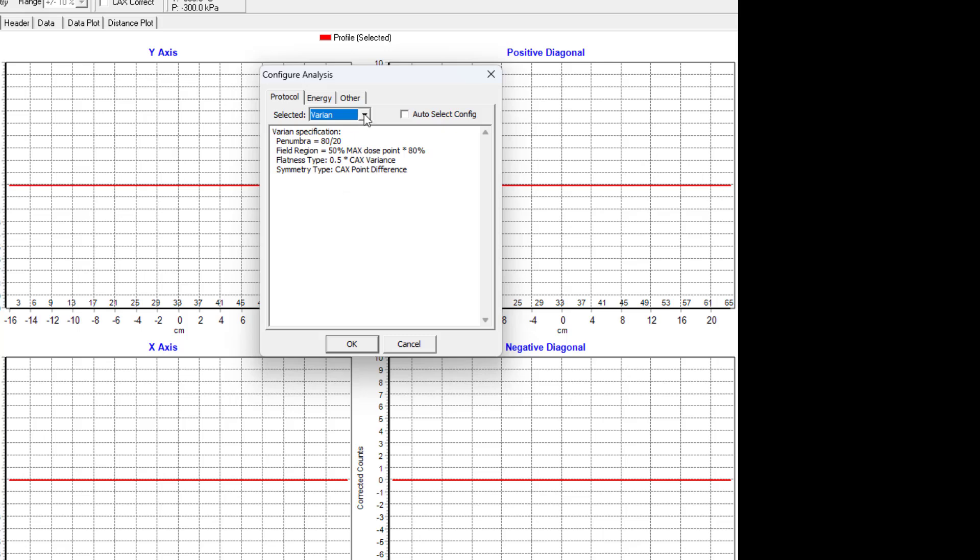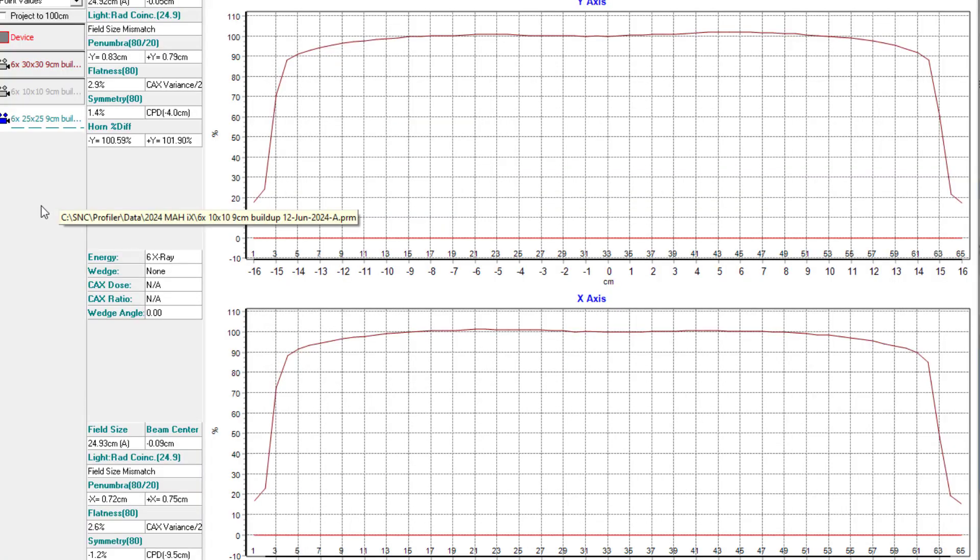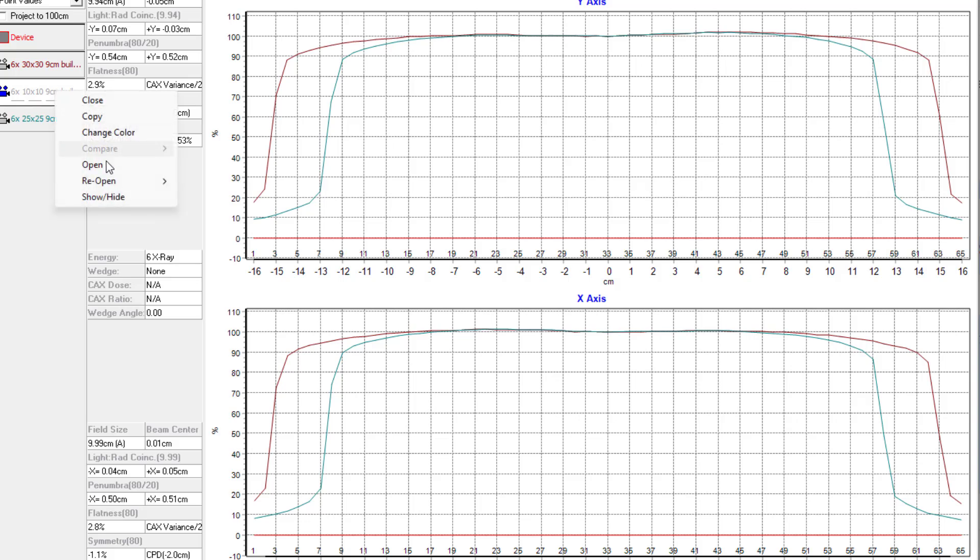And in the software, it's important to look at the different protocols for the analysis. And here we have a real beam. Let's take a look. We have a 10x10, a 25x25, and a 30x30. And we can see the software outputting the flatness and the symmetry.